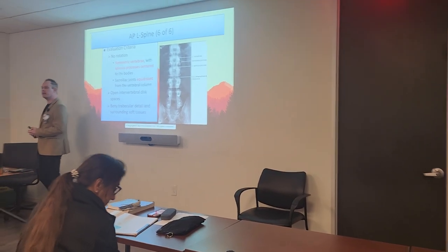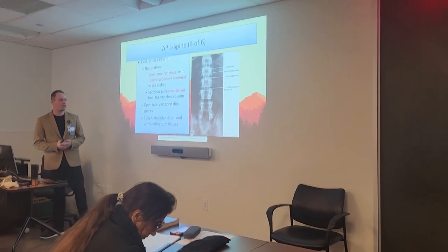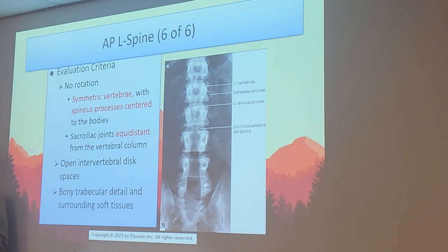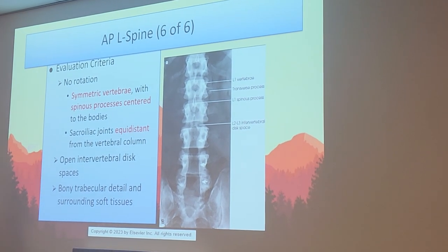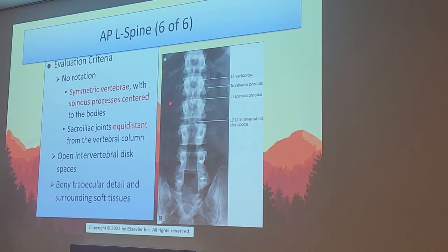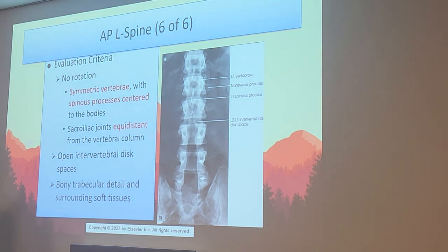Of course, we want to see a true AP. That means your vertebrae have those nice, beautiful, straight, rectangular shapes like you see in the picture right there. That's what we call symmetric vertebrae. We want the spinous process to be in the center. If you see that spinous process going to the left or right, it tells us the patient is rotated. Which actually happens more often than you might think, because imagine you're the patient, your lower back is killing you, what are you going to naturally do? Shift your weight. So you always have to be very careful before you take that x-ray. I'm sure some of y'all have experienced that by now with some L-spine patients.